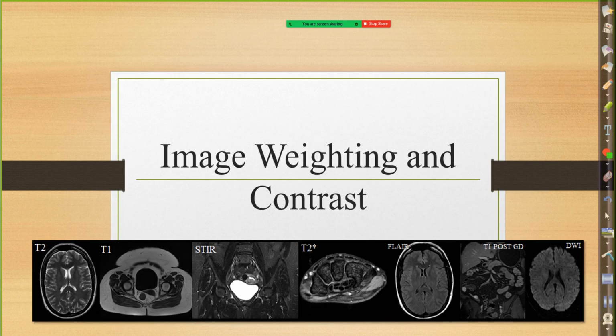All right. So we really discussed a lot about image contrast in these previous slides. Now we're going to work our way to image weighting and how we as technologists manipulate some of these parameters to get the desired image weighting. And we had all those extrinsic parameters, but the main ones we're going to discuss for this particular unit is TR and TE. So really highlight TR and TE back on that original slide of extrinsic parameters because those are really the only two parameters you need to adjust to get three different types of image weighting. Okay? We'll discuss that here.